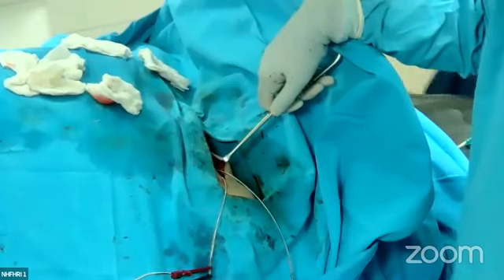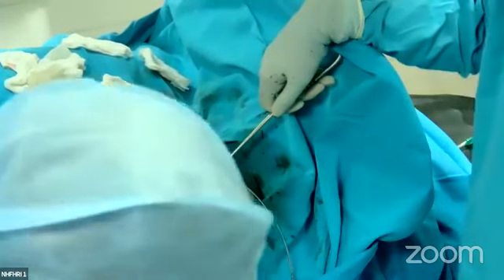First question is that the ECG, Dr. Shamim, the ECG which you have shown, is it a sinus arrest or an exit block?